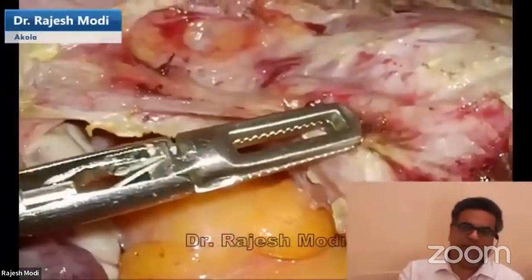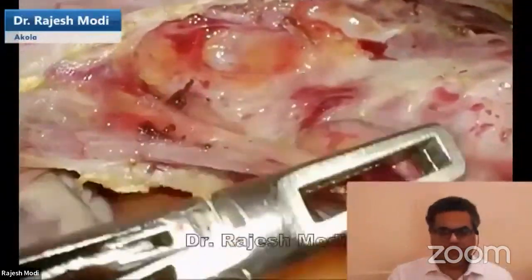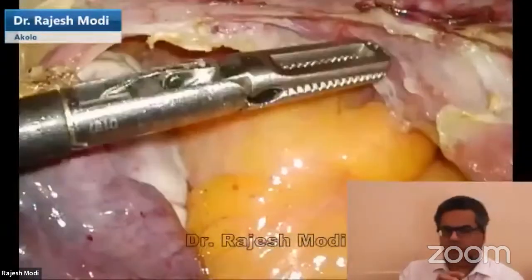Only in case of frozen pelvis, where the puckering of the uterosacral has pulled the ureter closer, I would want to be a little more careful about the ureter.